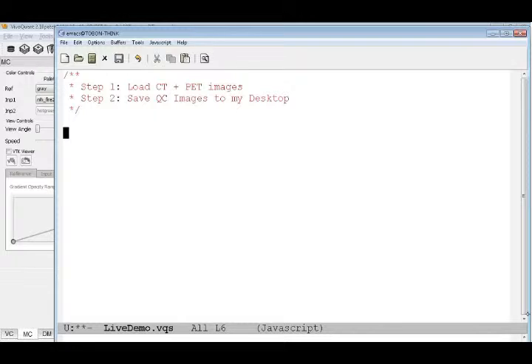The best way to load data from your iPACS, one of our developers has developed a really nice external tool written in VivoScript to be able to include and then download data from your iPACS. It comes with every installation of VivoQuant. I can include iPACS.vqs, and I get all the tools that come with iPACS.vqs. You don't have to open this up.